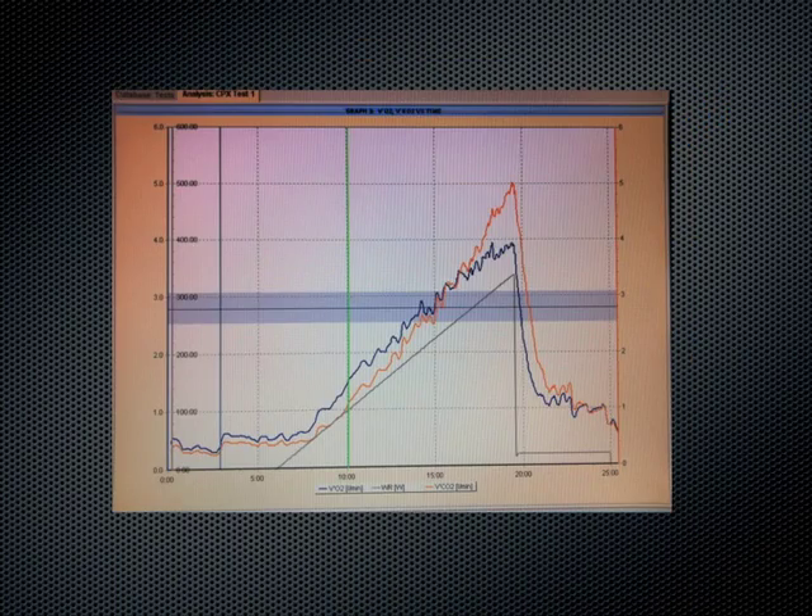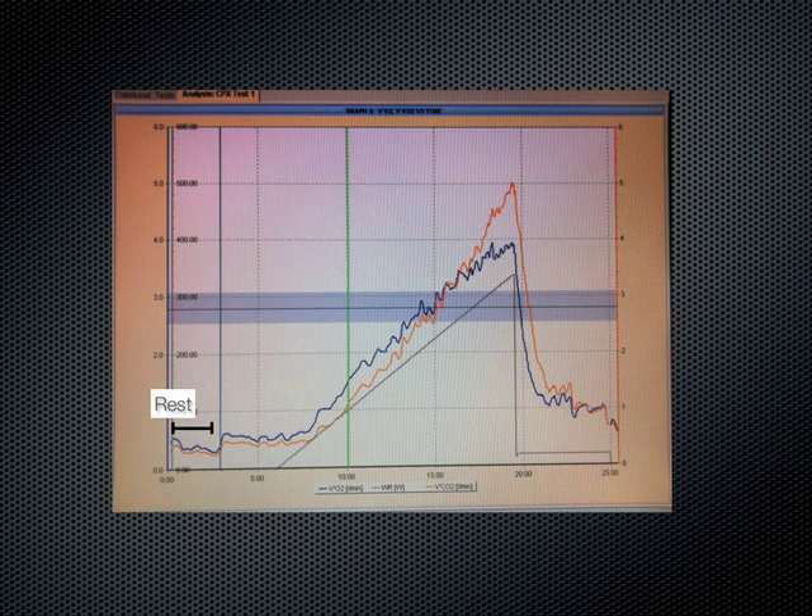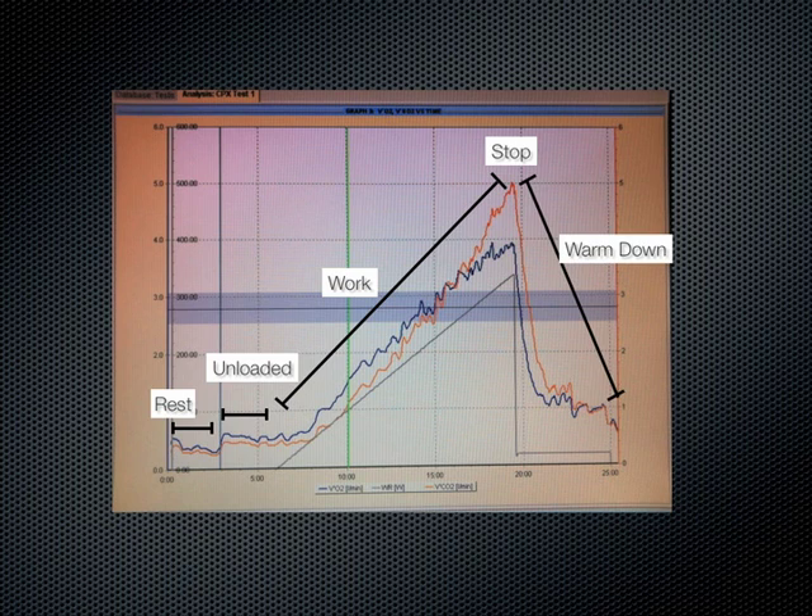This graph shows time versus VO2 and VCO2, both measured in liters per minute, and work, measured in watts. You can see on the graph the period of rest, where the patient sat on the ergometer without cycling, the period with unloaded cycling, the uphill cycling where the patient stopped, and the warm-down period. This plot is the first graph we look at because it is the most simple to interpret.